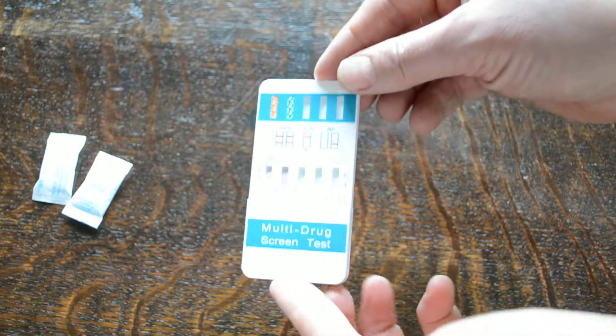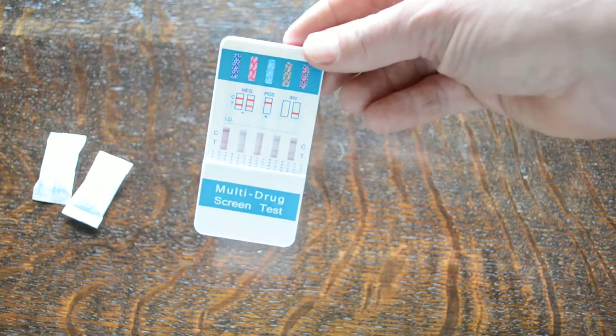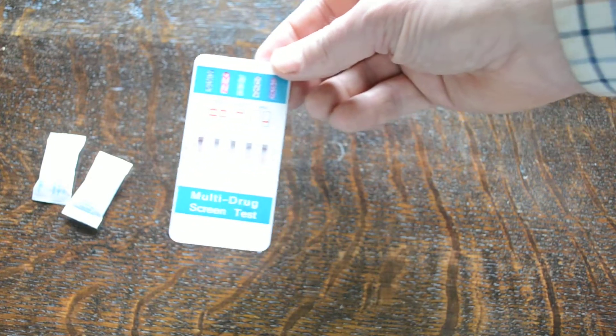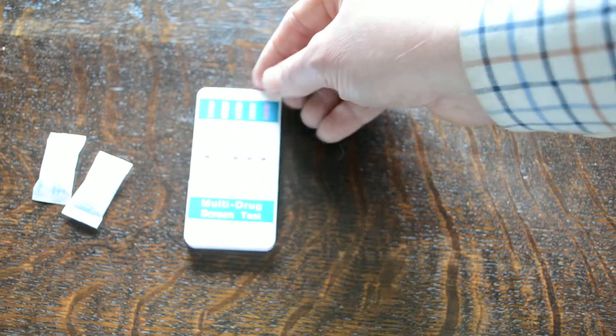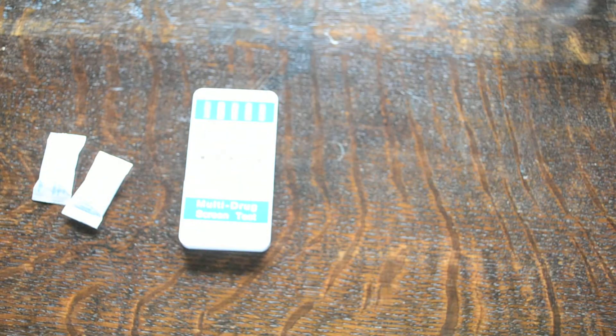So as soon as you see that clearly demonstrated, there's no need to wait for the full development time. You've got a clear negative test result on all seven parameters on this test membrane, so it can be discarded. Your results noted down for the sample and you can move on to the next test.